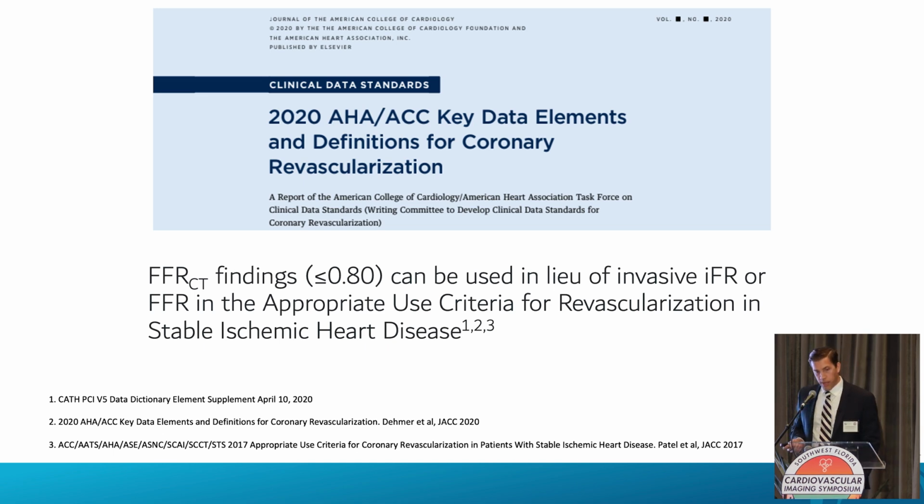It's also worth mentioning that FFR-CT findings can now be used in lieu of invasive iFR or invasive FFR based on updated appropriate use criteria for revascularization for stable ischemic heart disease. So if a patient undergoes CT with FFR and there's a stenosis that is functionally significant, positive FFR, that is grounds for revascularization, all right? Now, obviously, a lot of interventionalists are still going to confirm this invasively in their lab, but that stenosis would be greenlit for revascularization based on the CT data alone.